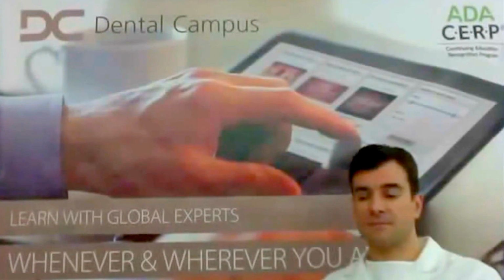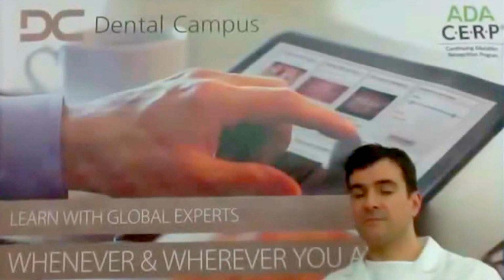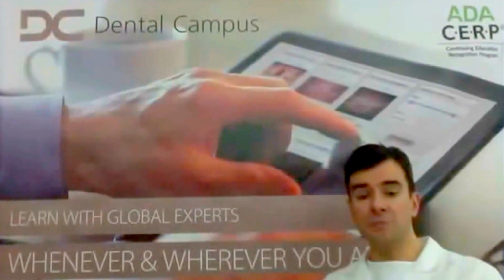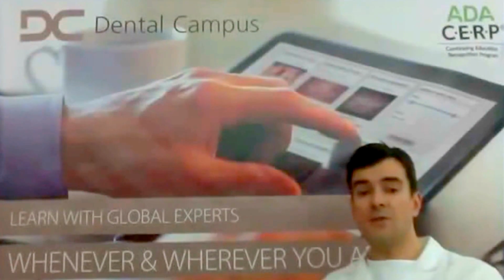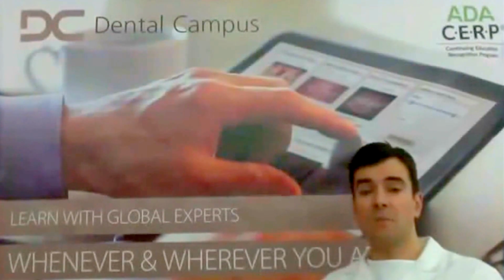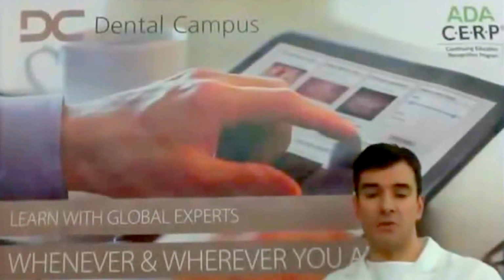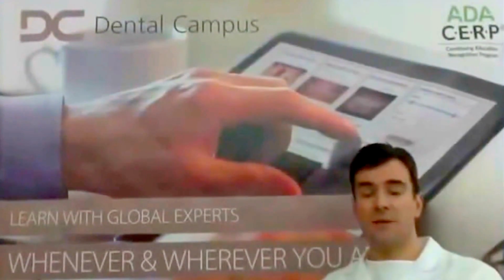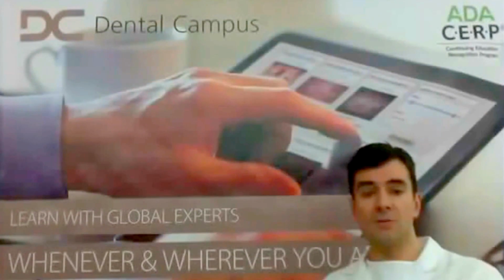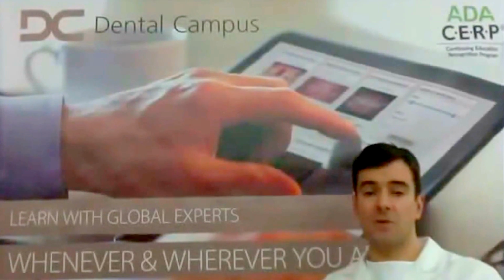Does the incision technique change if there are neighboring implants instead of teeth? Yes, absolutely yes. In case of adjacent implants, we always use a papilla preservation technique, and we always use a paramarginal technique. If you have a tooth, you might decide to cut the papilla. You might decide to place your incision in the sulcus. But with an implant, we never do this because we want to avoid any type of bone loss on an implant.